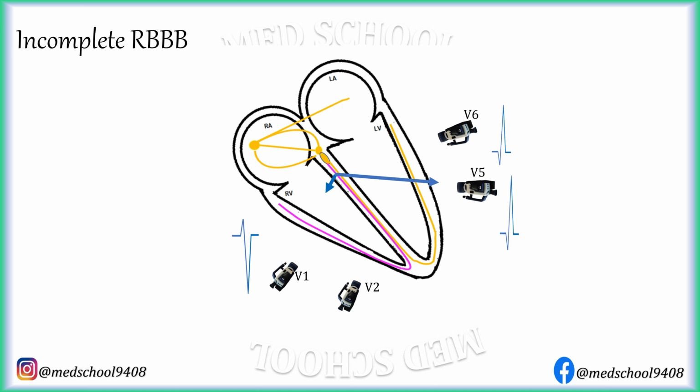In incomplete RBBB, conduction is not blocked but only slow. Due to this, left ventricle and this part of right ventricle are depolarized at the same time. As V2 electrode is placed over this area, changes of incomplete RBBB are seen first in lead V2. Left ventricular activation vector is counterbalanced by vector of activation of this area.